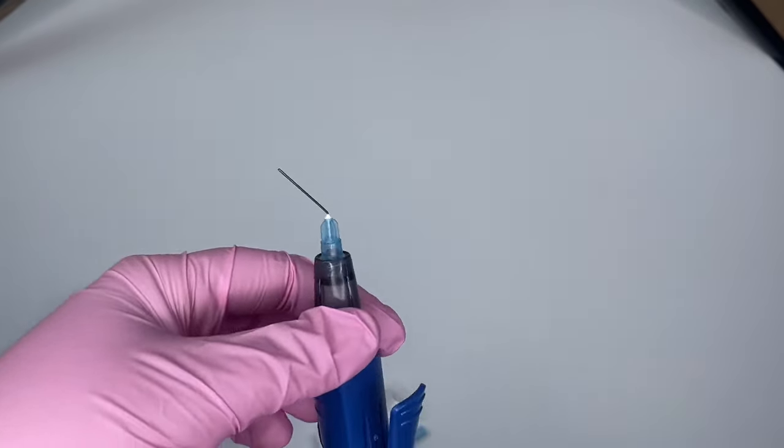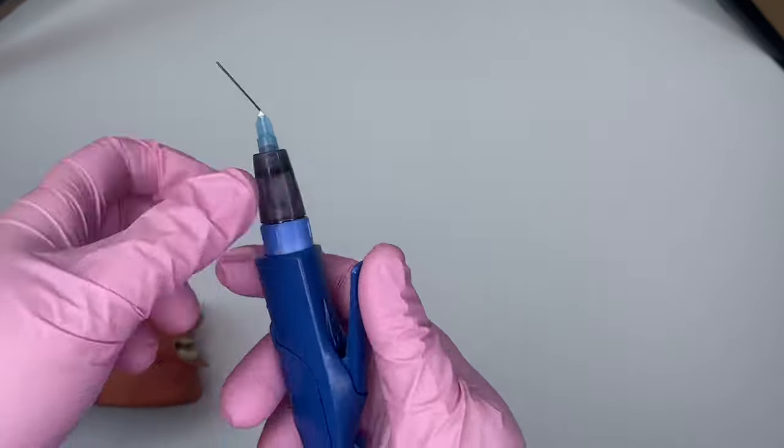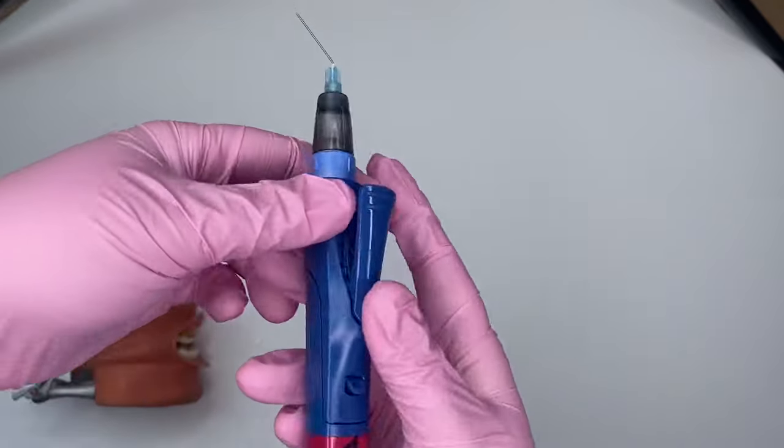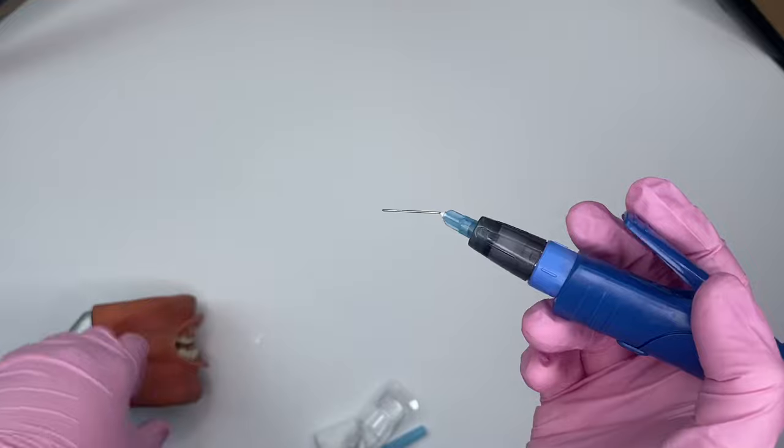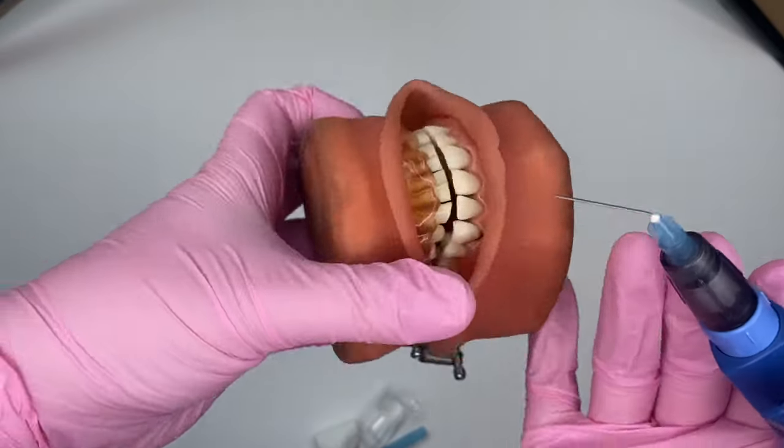You can hold it in a modified pen grasp or palm grasp. I personally use a modified pen grasp, and you're going to place it right by the gum first.